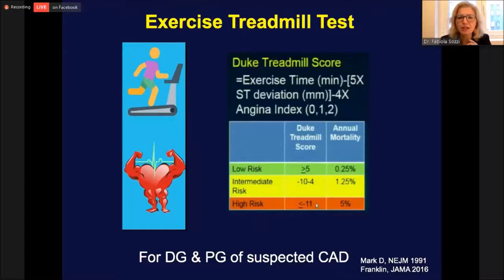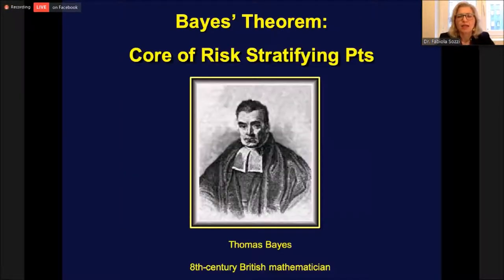Stratification means evaluating the capability of the test of being diagnostic and prognostic for patients with no wall motion abnormalities at rest. In general, about stress echo, here with the ECG test, it was an ECG that was normal at rest. It's very important to talk about stratification and to talk about risk, pretest risk.